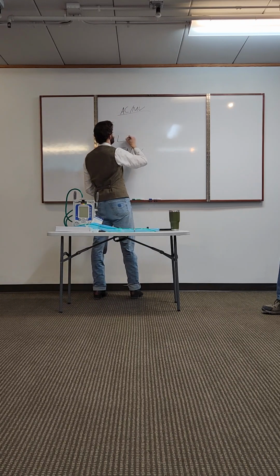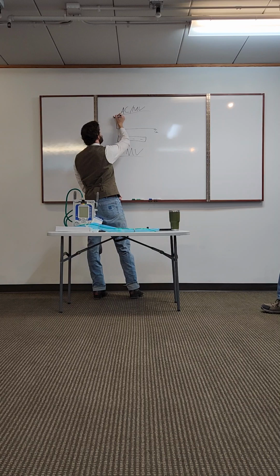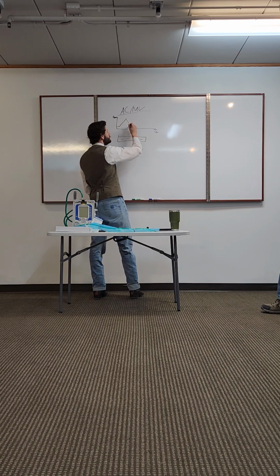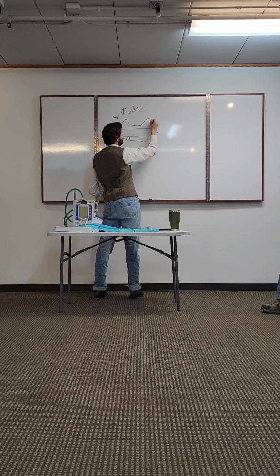Across, this will be the axis of time, and this will be pressure. So pressure, time, we're going to have our waveform, we go like this, the vent's going to ventilate, and then whatever you had the respiratory rate set to is when it's going to go again.